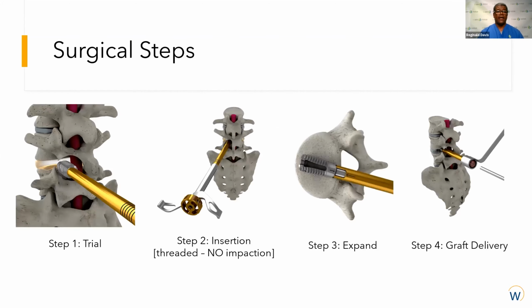device migration. The surgical steps really start after the surgeon has exposed and approached the spine in a manner in which you're most comfortable for the given patient, and then the disc has been evacuated and properly prepared. At that point, the trialing step can begin. There are several trials, which can be the usual paddle type distractors. Some go in with rotation, others just slide in.